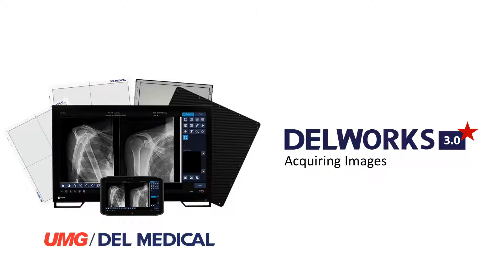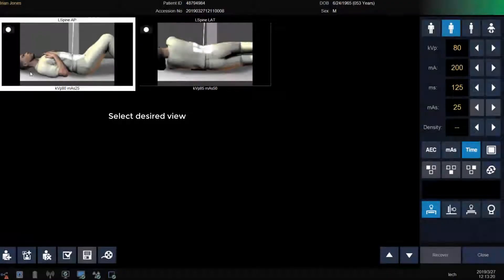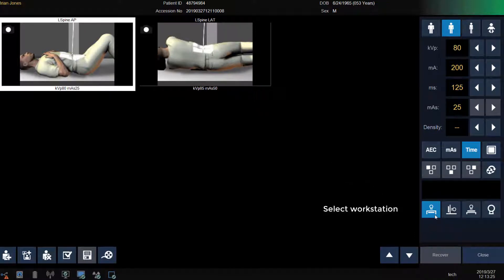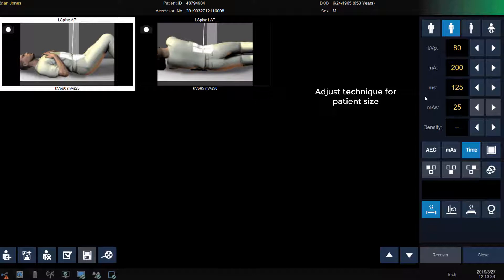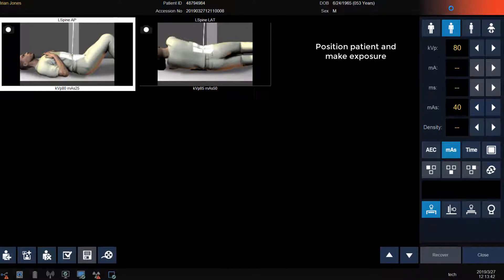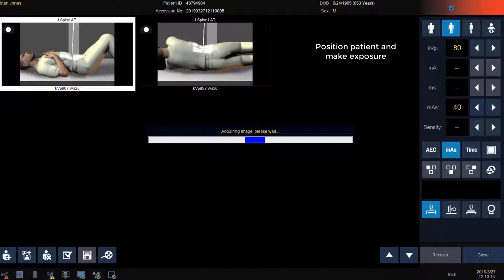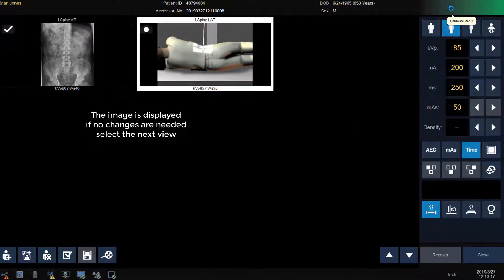Acquiring images from the acquisition screen. We can now click on the view we want to start with first. Verify or modify our workstation. Modify our generator settings if needed for patient size. Position our patient and make our exposure. After a few seconds, the image will be displayed in the small thumbnail. If no changes are needed, you can select the next view and repeat the steps.